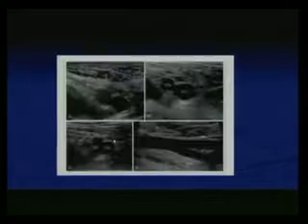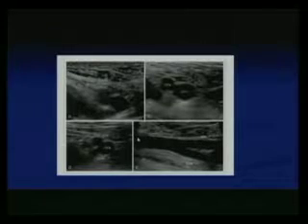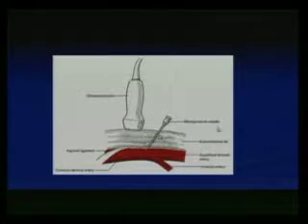also. On the ultrasound, you can look at the common femoral vein, the common femoral artery, and then bring your ultrasound down, and then you can visualize the SFA and the profunda. And then you can do a longitudinal view also. And then here's your ultrasound probe.